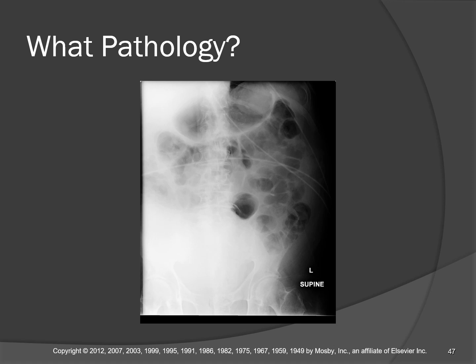It's not as effective because the tissue isn't as dense as bone matrix, but iron's got a pretty good atomic number. I think it's like 42 or something like that. Don't quote me on that. You can look that up yourself. But blood pooling will attenuate. So hematomas will show up as radiopaque objects.